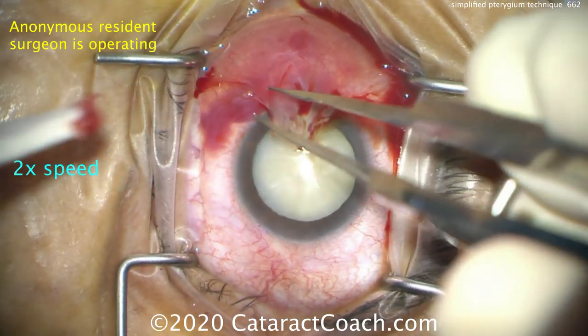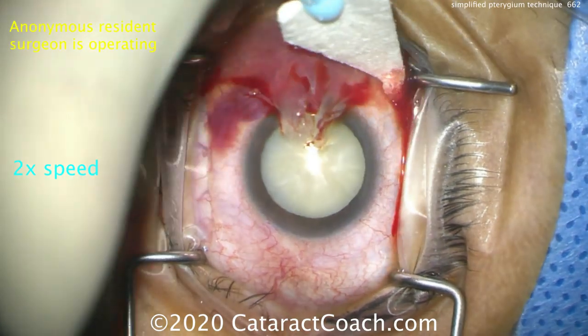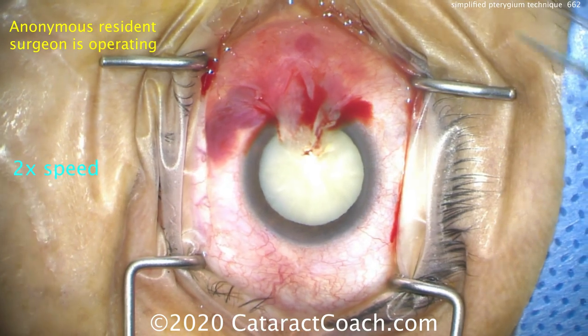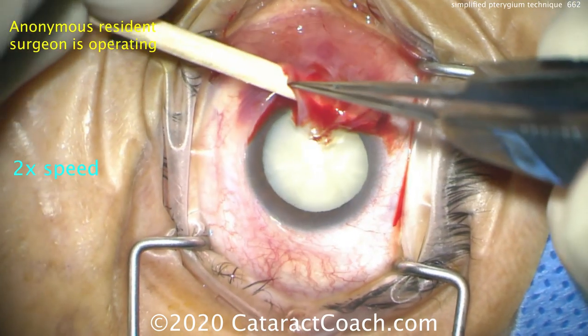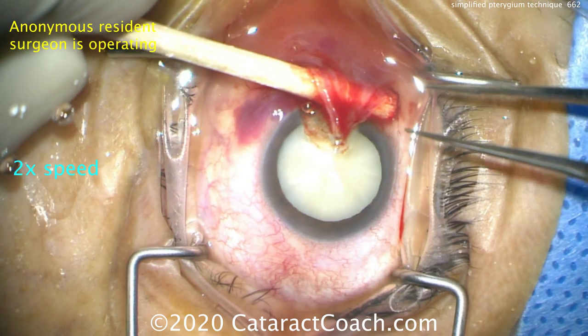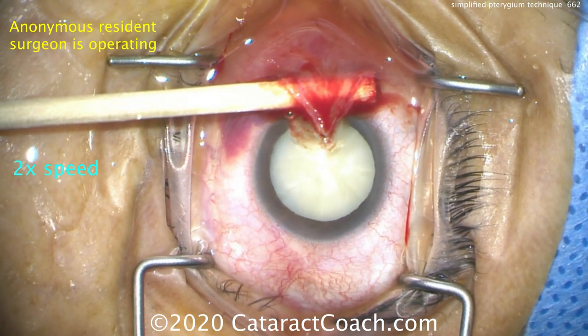Clean that up a little bit. In this technique, we're going to place the back end of either a weck-cel sponge or a cotton tip, and use the shaft of that to go underneath in that tunnel and tent up, putting traction on the pterygium and its corneal attachments. Look at that traction — you can see it being held.